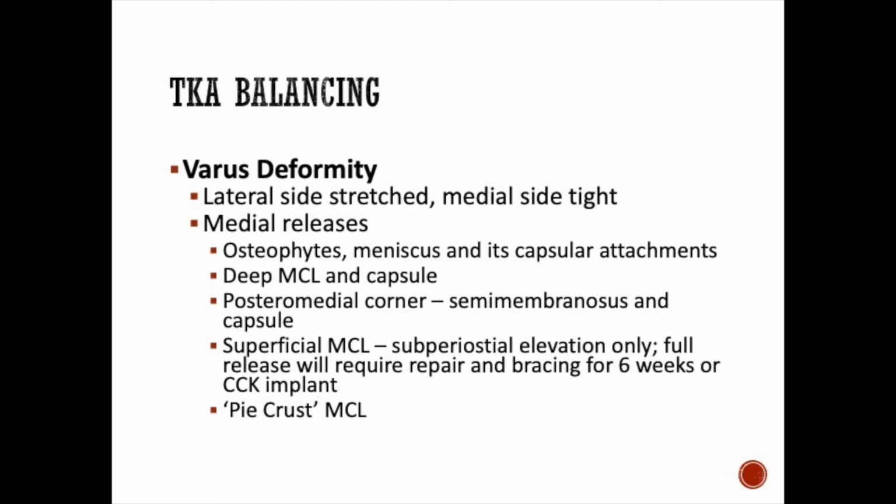This will probably release the MCL entirely, which means you're either going to need to balance the knee and then repair it there where it's balanced, or you're going to have to switch to a constrained condylar or varus valgus constrained knee implant. Another option might be to pie crust the medial collateral ligament, but be careful of over weakening it to where they rupture it postoperatively. So if you do a technique like that, you might want to put them in a hinged knee brace to protect that MCL while it scars back in.